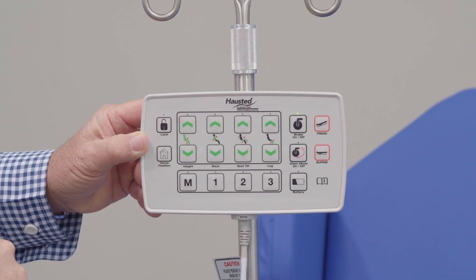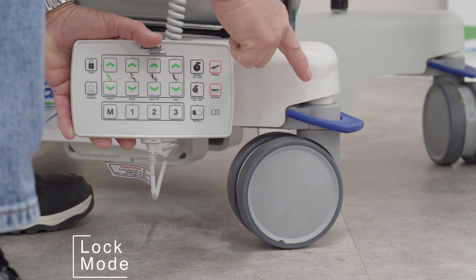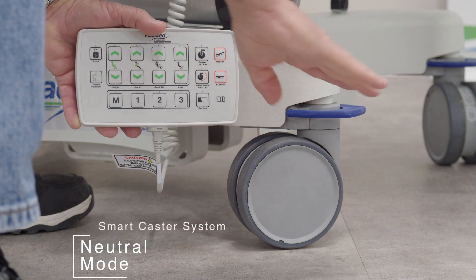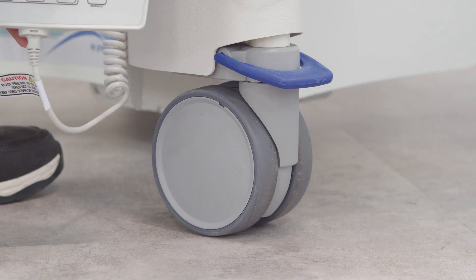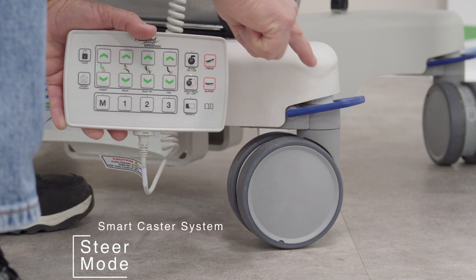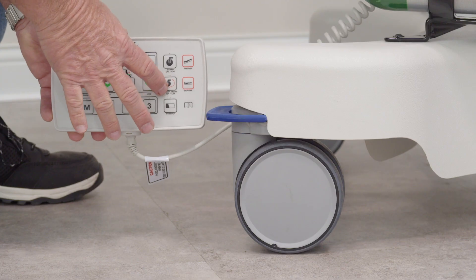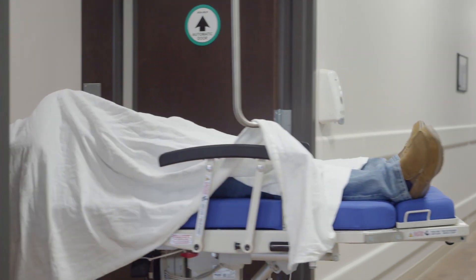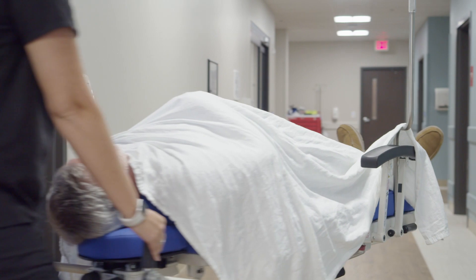The additional actions are the following: Lock mode. Neutral, when the blue tabs are parallel to the floor. Steer mode is when the two foot-end tabs are in the fully up position and the two casters on the head end are in the neutral position. This allows for straight tracking and easy steering around corners.